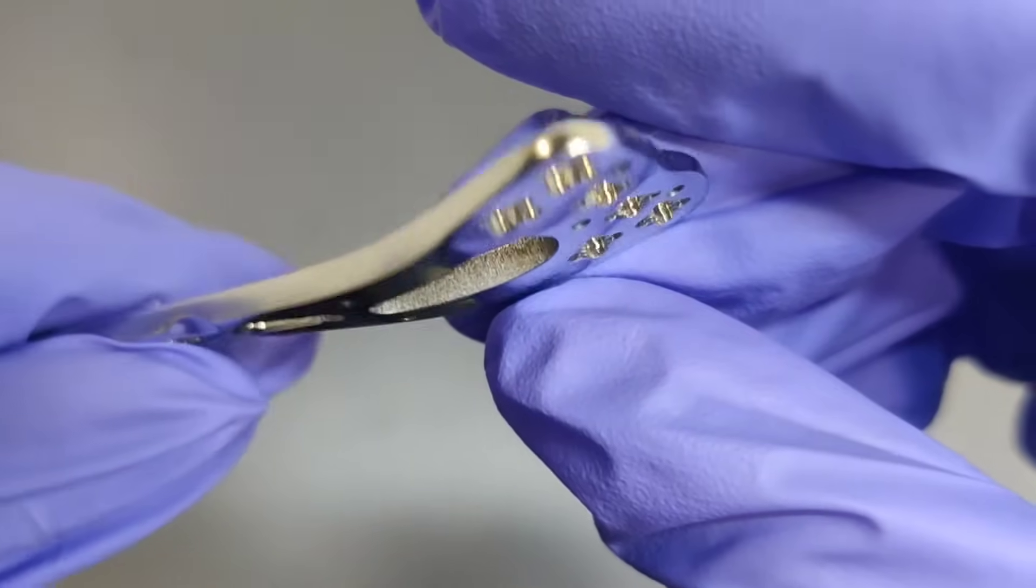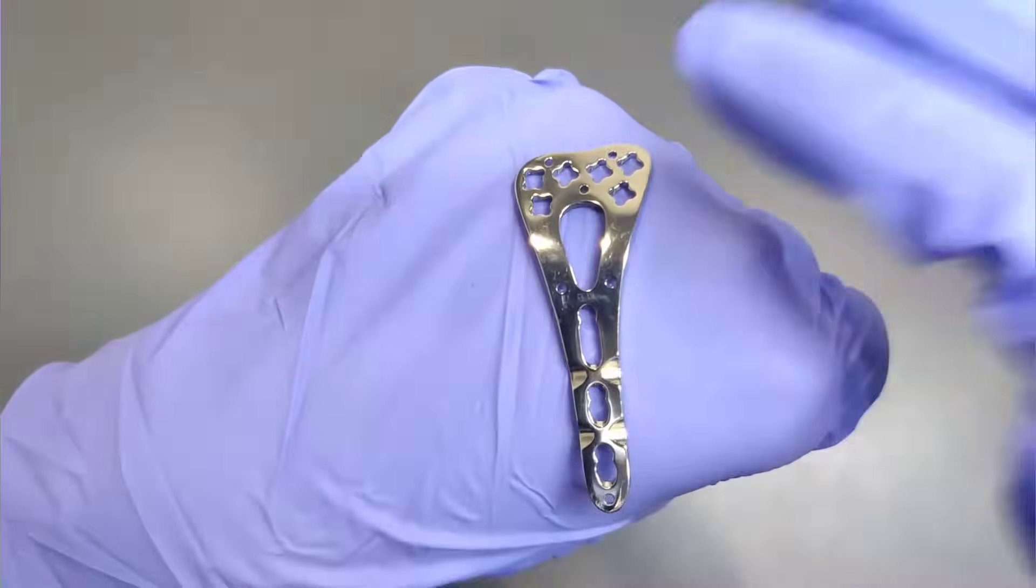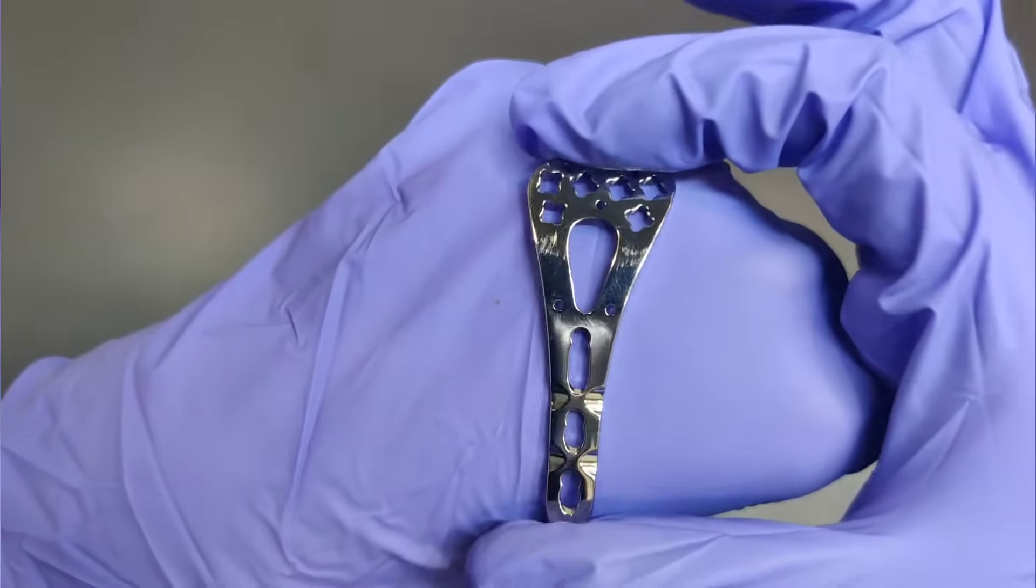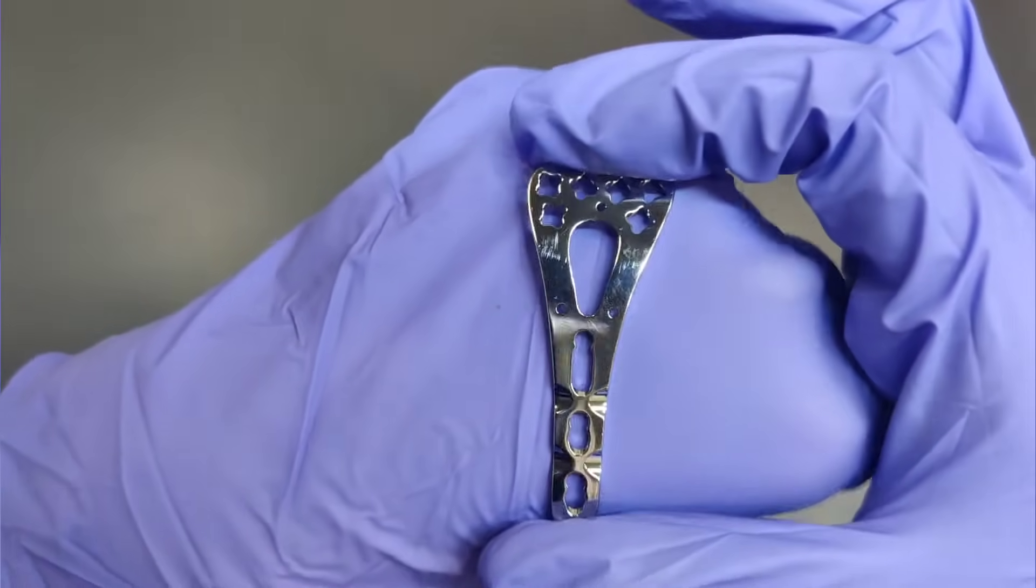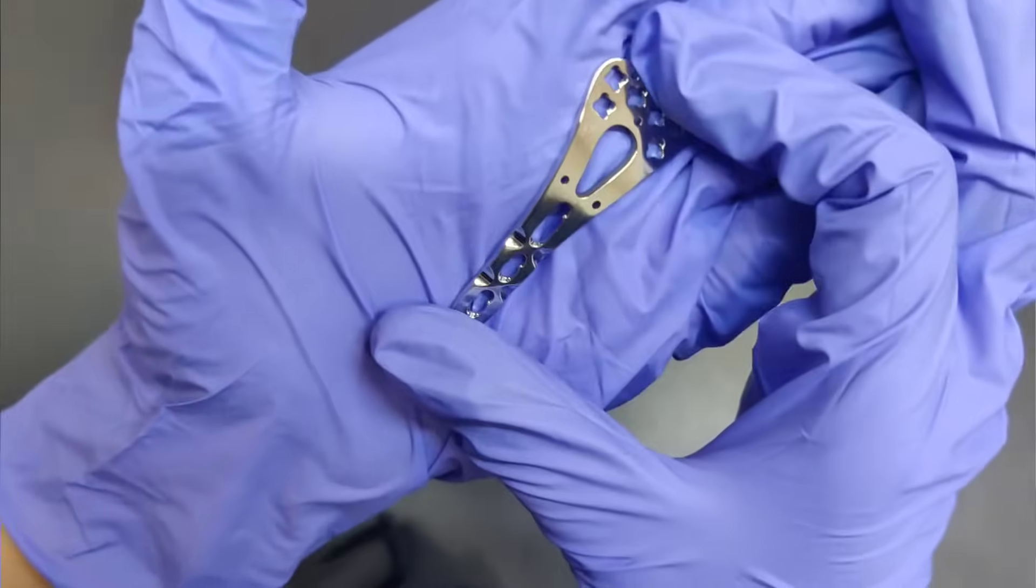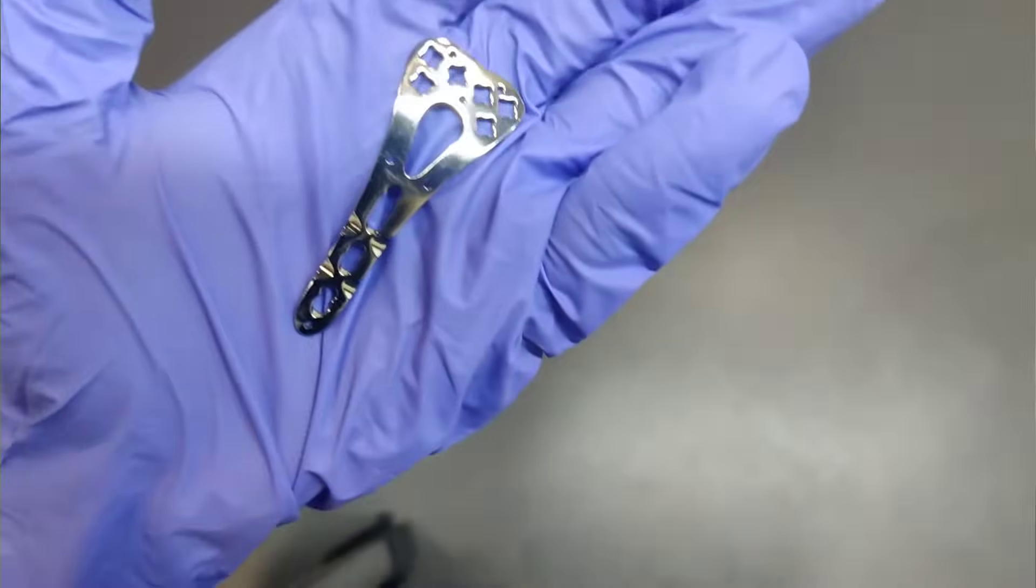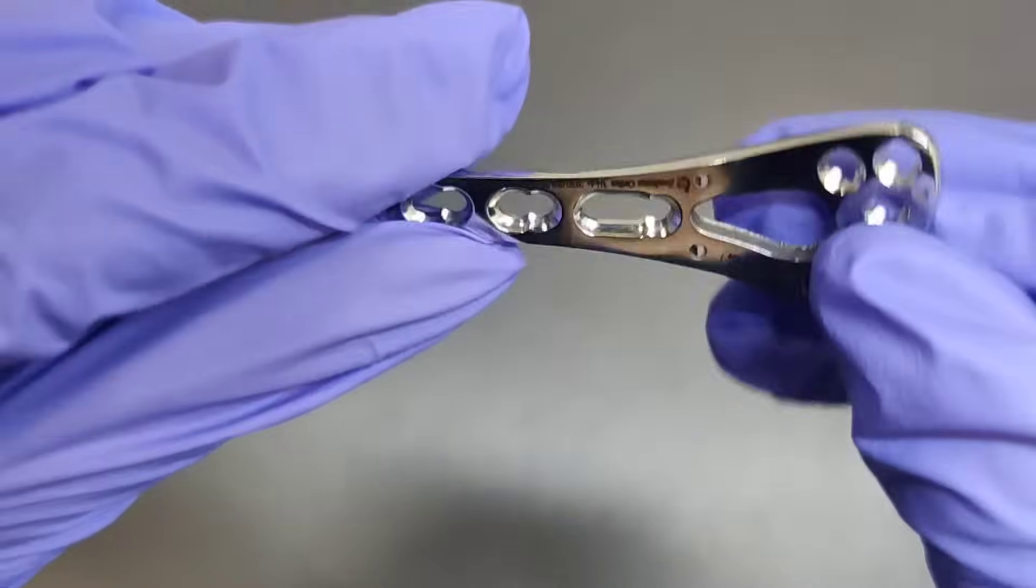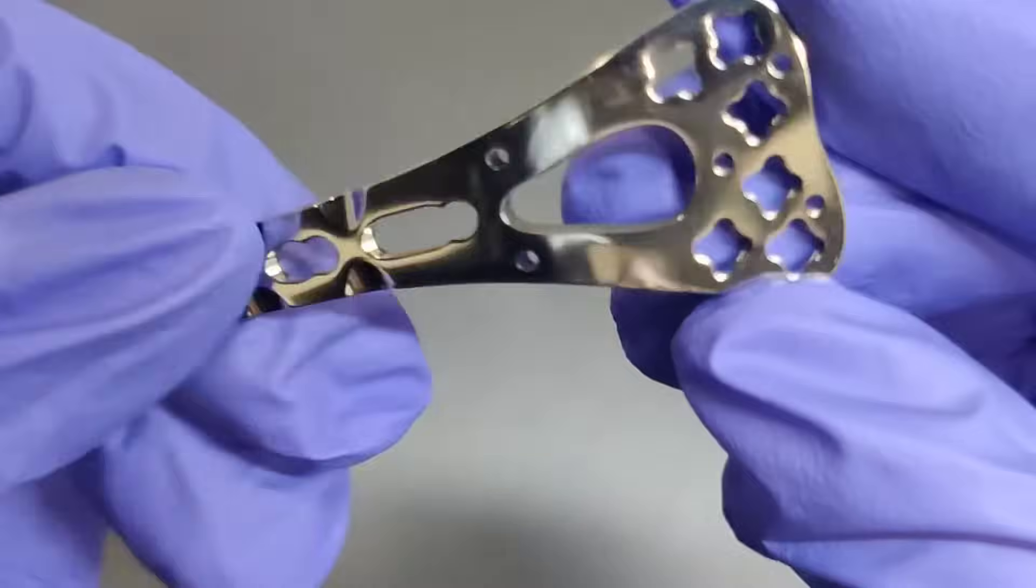Available in various configurations with 2, 3, 4 and 5 holes, the LCP Volar Distal Radius Plate is meticulously crafted using premium materials, boasting both stainless steel and titanium options to meet diverse patient needs.